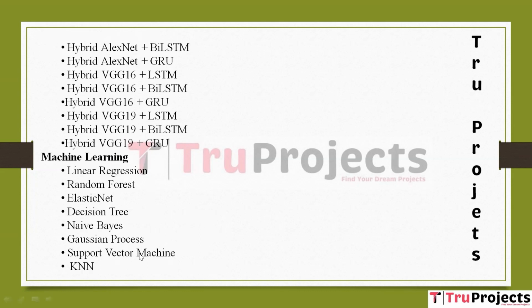Machine learning algorithms. These are the machine learning algorithms used in this project. Linear regression. Linear regression is a simple and widely used supervised learning algorithm for regression tasks. It models the relationship between a dependent variable, in this case sleep apnea prediction, and one or more independent variables, features from ECG data, using a linear equation. It can provide insights into how different features correlate with sleep apnea.